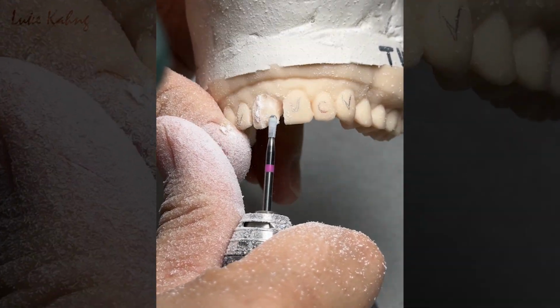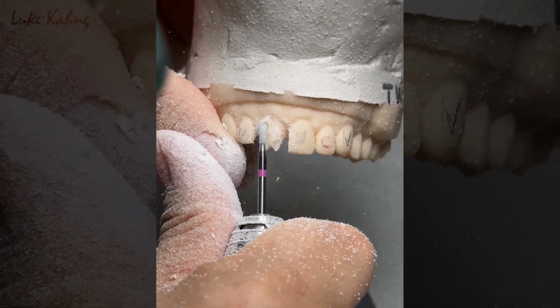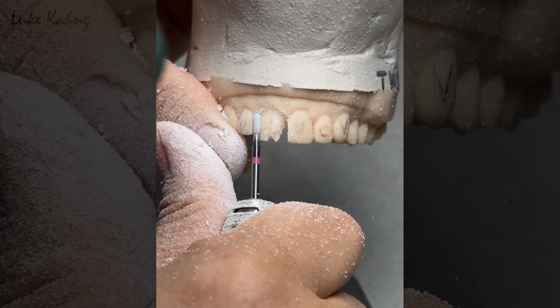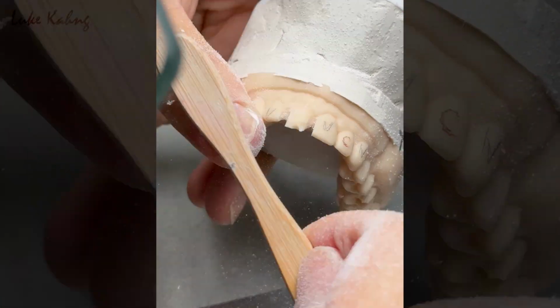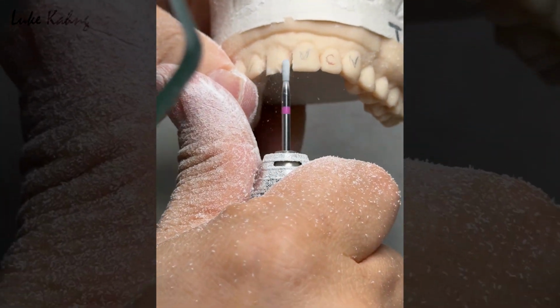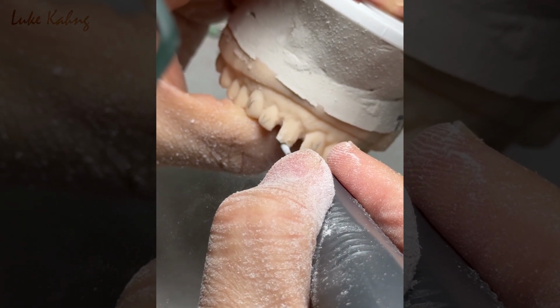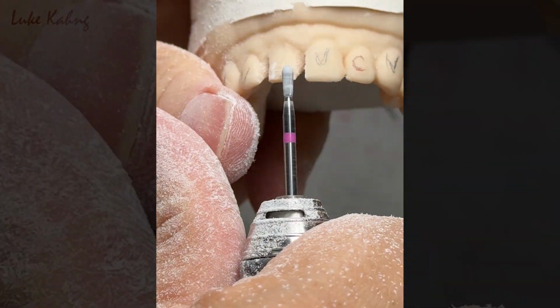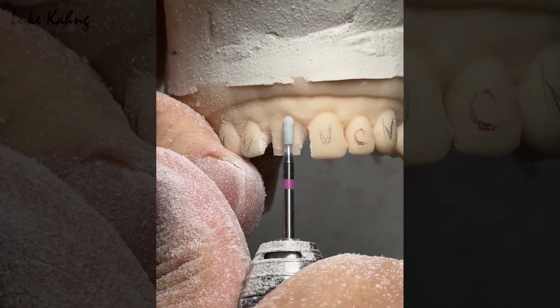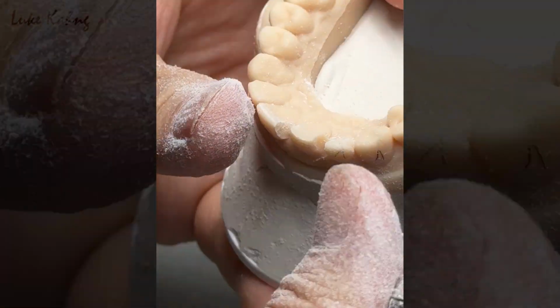At least 2 millimeter. See? Inside shot. I want a little bit deep shoulder. The margin, that's good too.